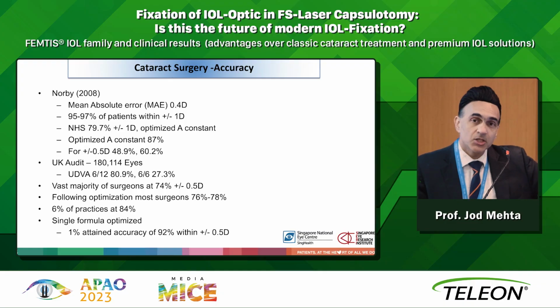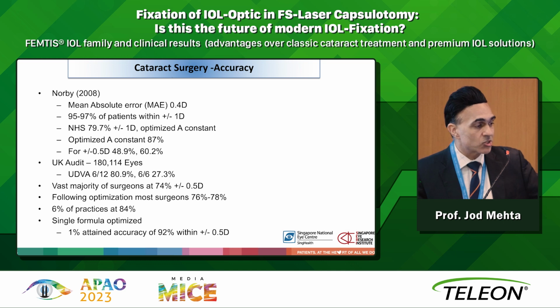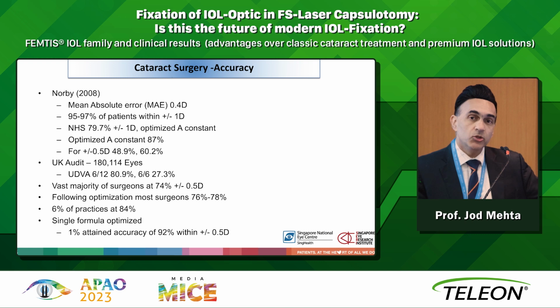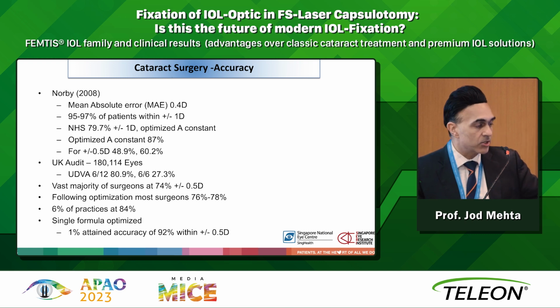And the idea is that now cataract has transitioned from a therapeutic procedure, which is what we were probably doing in the 80s, to much more of a refractive procedure now, where we're trying to push the limits of what we can give our patients. So it's no longer the fact that I can put a lens in, you can wear a pair of glasses, and you can see well. The concept has changed now, and we're really pushing the barriers to push this limit of what we can actually achieve.